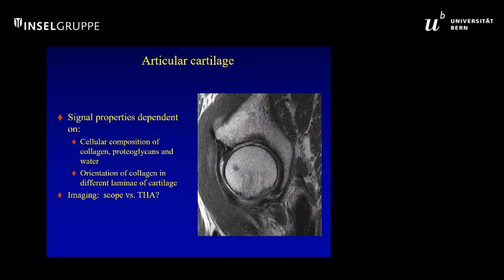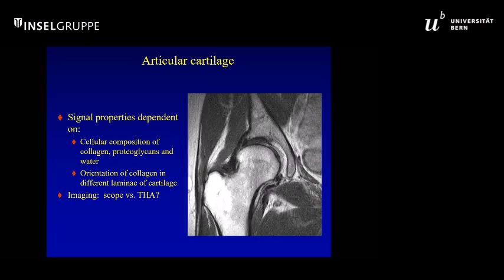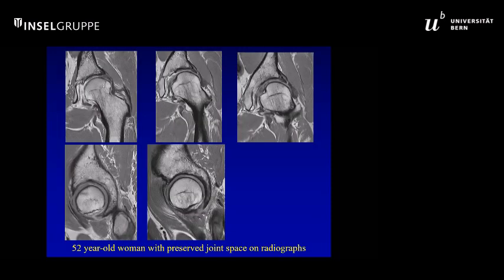So if we look at this patient as sagittal images, you can see extensive bone-on-bone opposition, so clearly would be arguably not amenable to an arthroscopic approach. But if we look at this patient with dysplasia, the cartilage thickness is relatively preserved, and if you look carefully, you can actually see loss of grayscale stratification. So the cartilage thickness, while preserved, is abnormal in terms of its collagen orientation and grayscale. So the presence of preservation of joint space on an X-ray does not preclude significant chondral wear.